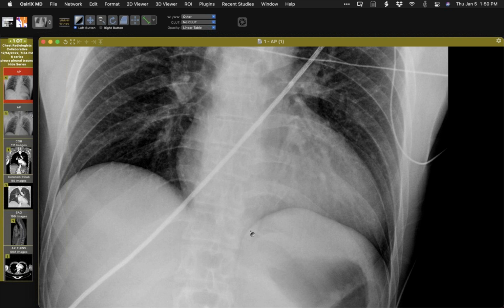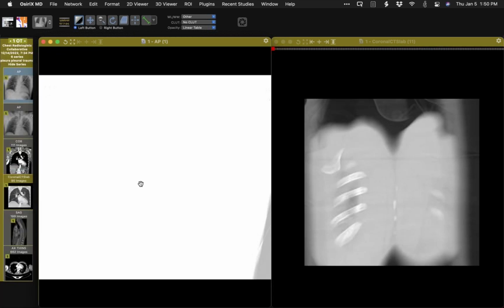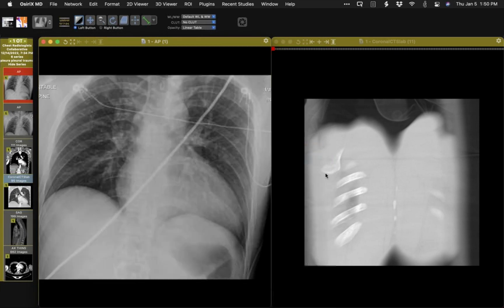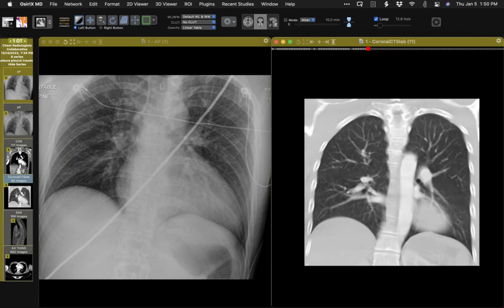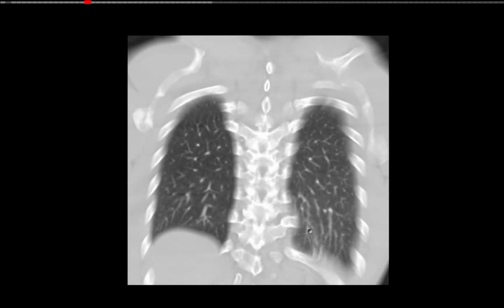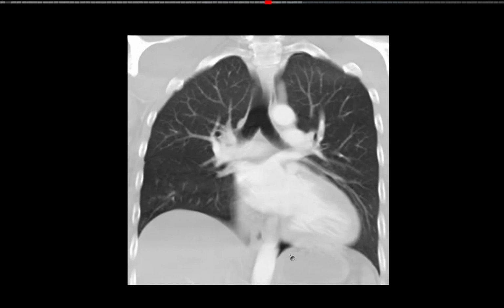I don't think that's been given a name, but the corresponding location of the air, sorry about that, that got all messed up. Let me just try and fix that for you. I don't know why this does this. Go default. And the location of this air is actually here. So it's relatively posterior. So in the posterior chest, anterior, we see that, then we start to see that air.